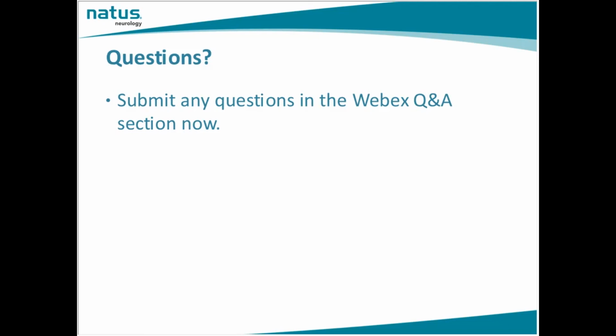Thank you very much. If I have flow in both directions at a depth of 48 in an adult, could this be my MCA-ACA bifurcation?